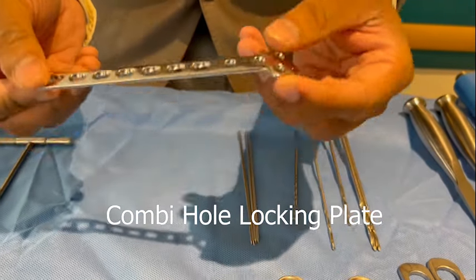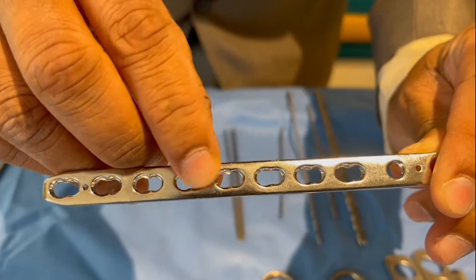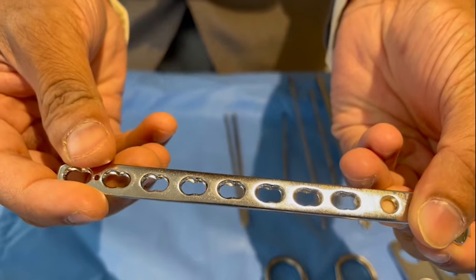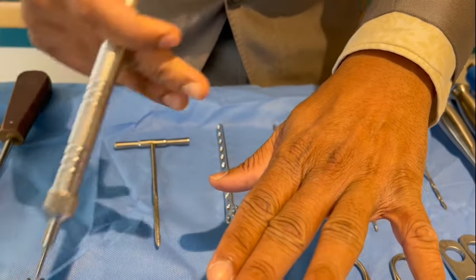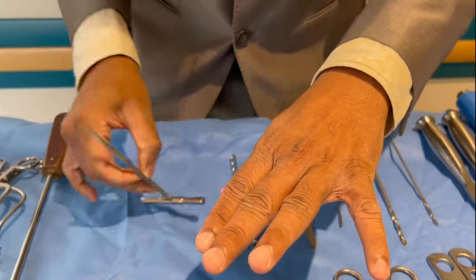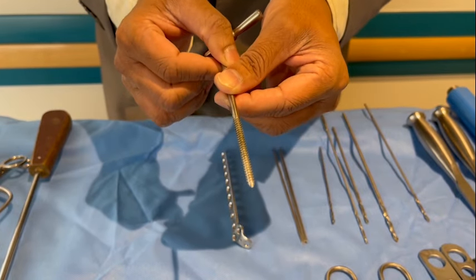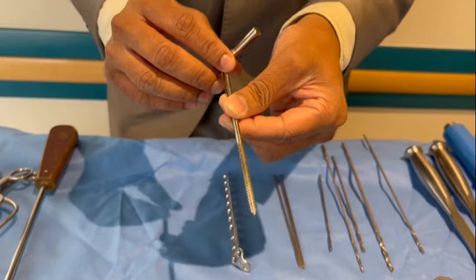This is a combi hole plate — it has dynamic compression holes and also locking holes. The locking hole's inner part has threads that lock the locking screw head to the locking hole threads. Once you have drilled the bone and assessed the depth of the drill with the depth gauge, you use a tap to create the threads before inserting the screw. This is not needed for a self-tapping screw; however, if the bone is very strong, you have to at least make an entry with a tap so that it becomes easy to push in the screw.